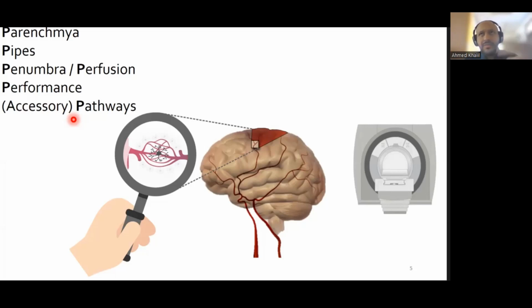That being said, I'll be mentioning some other non-MRI modalities as we go along, because in specific situations, some of these modalities might have more advantages than MRI. One of the most common ones is CT, for example. Computed tomography is very widely available. It's relatively cheap. So it's very often the first line of imaging, basically to exclude certain things when it comes to managing stroke patients. But overall, I think MRI offers the largest repertoire of tools that we have in order to assess these pathophysiological processes.